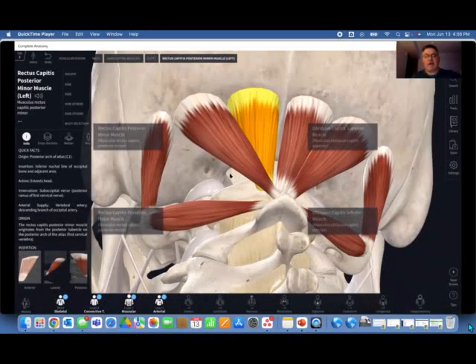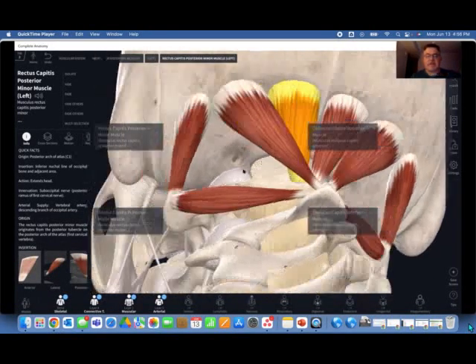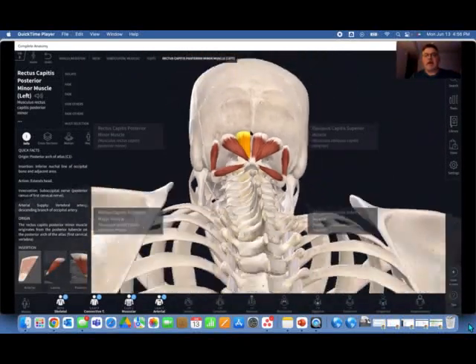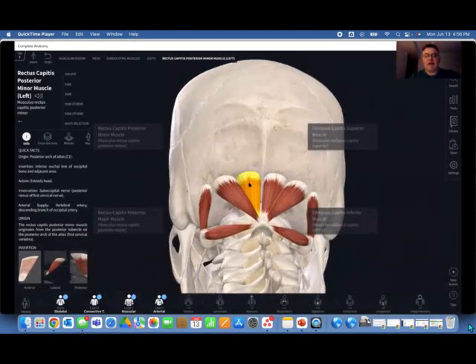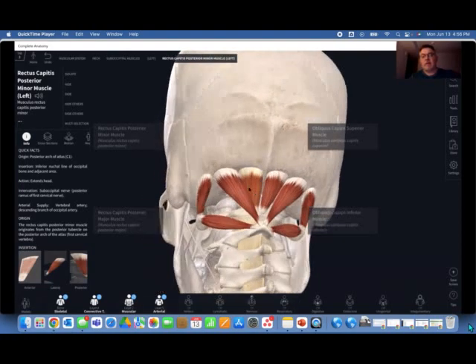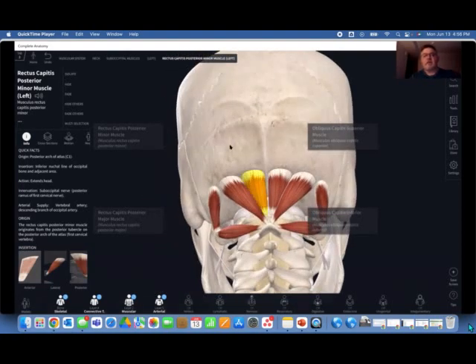Well, the problem there is, again, in this general area, we can see there is the foramen magnum, and if we really want to make a good effort at hitting the rectus capitis posterior minor, then we do have to orient our needle angulation to the foramen magnum. The problem is, we don't want to do that. The bigger issue is if we take too much caution in this posterior approach, then we will more than likely land in between superior nuchal and inferior in this area, which means that we're not really hitting our target structures.